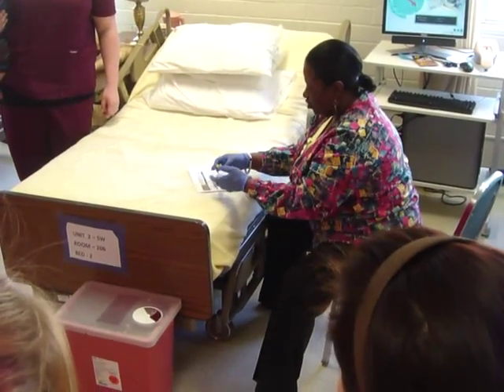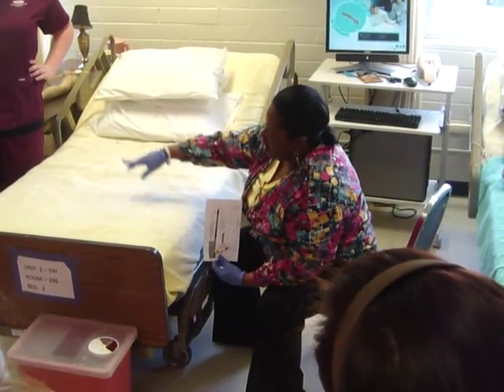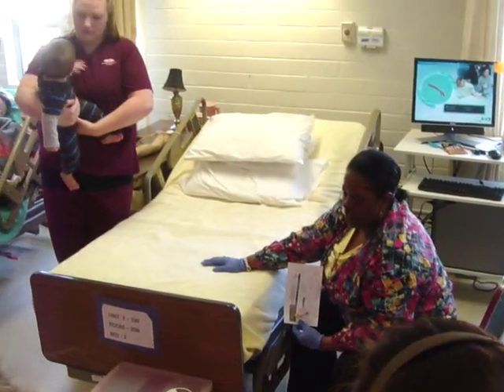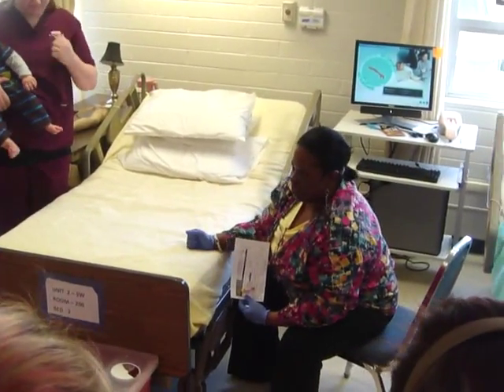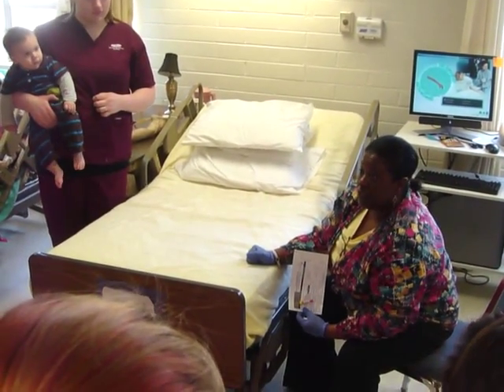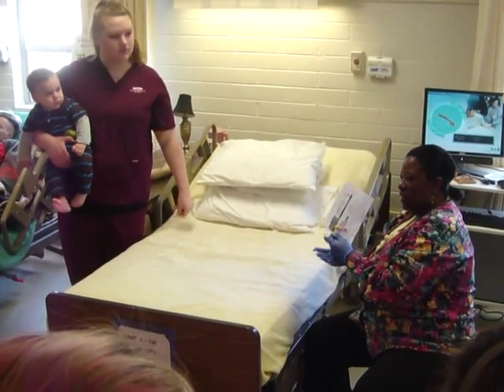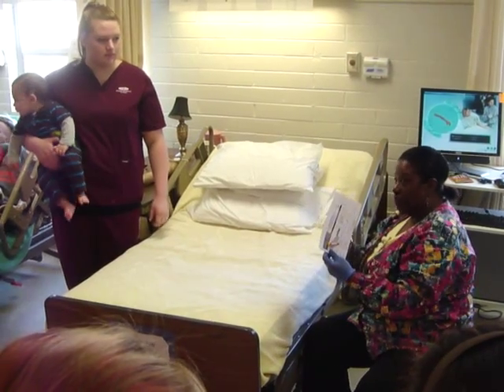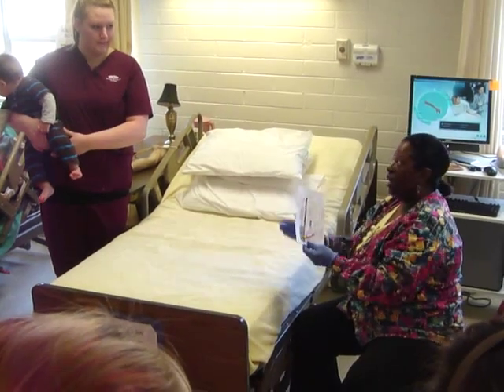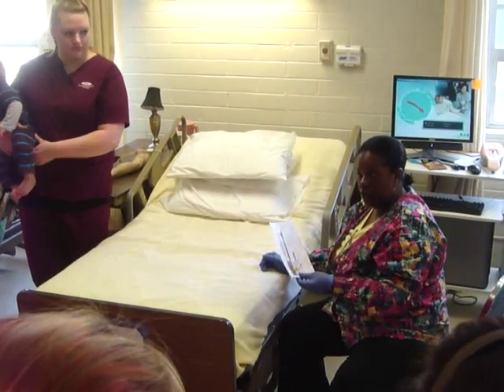You have to make sure, for infants, nothing is left undone. As far as bandaging, you never want to bandage a baby per se. You really want them to keep the cotton on until it's clotted off. If that's the case and you have to bandage anything, use a small bandage and put the sock or whatever they have on the foot back on. Educate the mom to take it off as soon as they think it's safe.